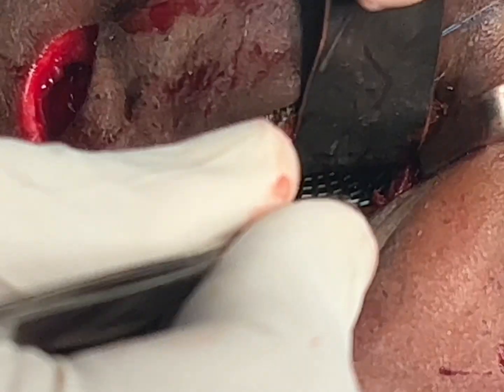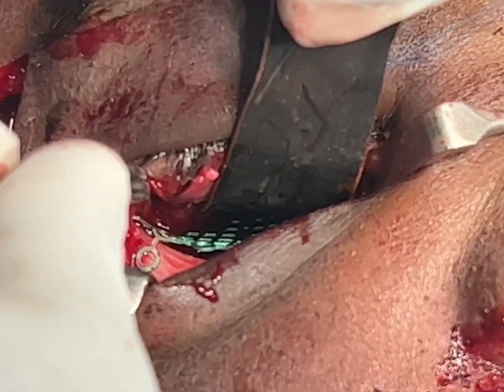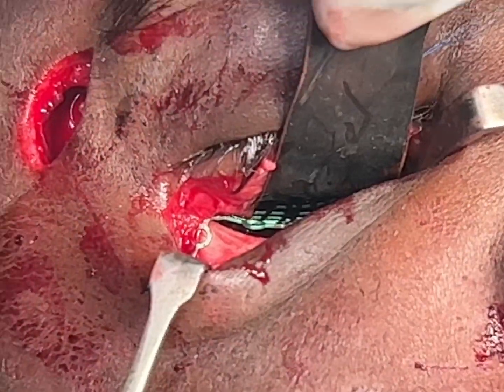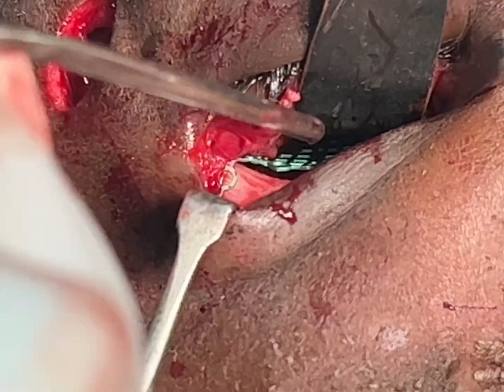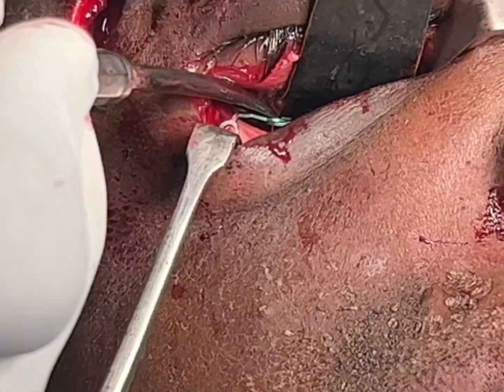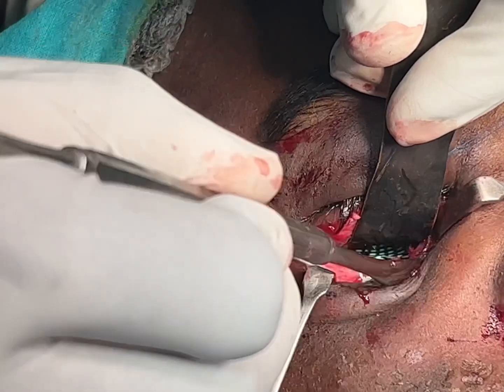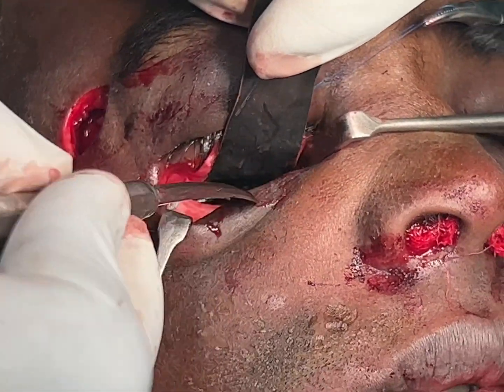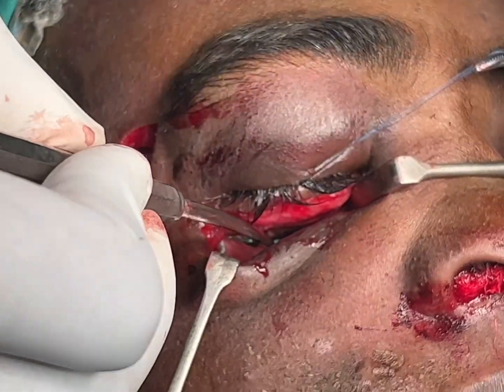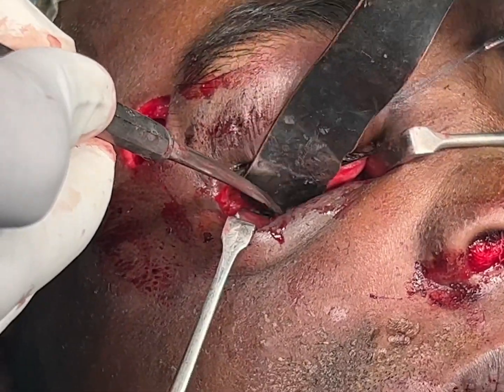Basically it sits there with gravity and it reduces the floor size. By reducing the volume of the orbit, it prevents enophthalmos. It usually doesn't reduce the orbit to exact pre-accident levels, but it reduces the size because there's an onlay on the end of it, as you can see on the orbital rim.